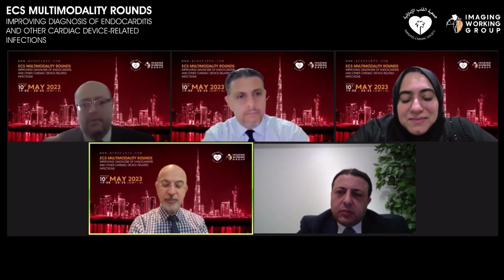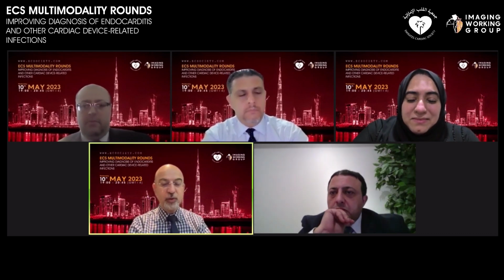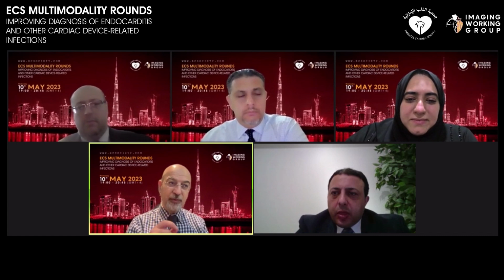That's true. I can start, and Dr. Mu'adh can also comment. We see this on occasions when we read echoes that there are things that look suspicious. Again, we have to remember that it's all a clinical diagnosis, and I mentioned the modified Duke criteria, but with a caveat that it has low negative predictive value in patients with prosthetic valve endocarditis. So it performs better in patients with native endocarditis, but for prosthetic valve, when you just go to the modified Duke criteria, it may not perform as well.